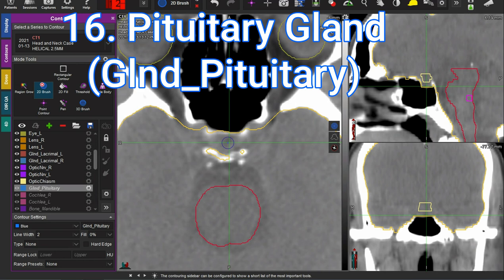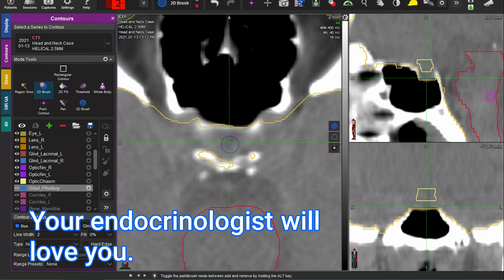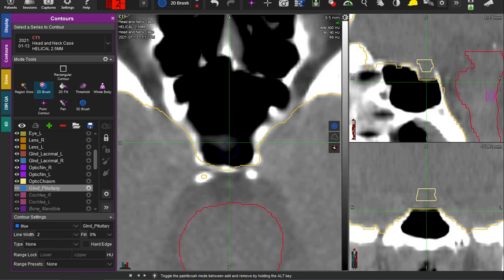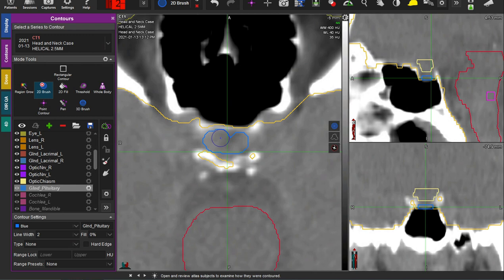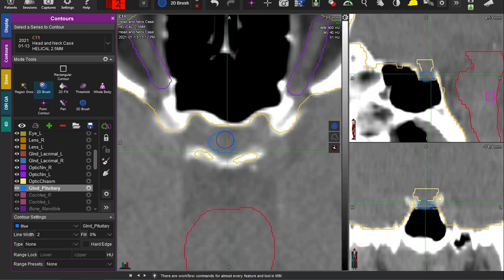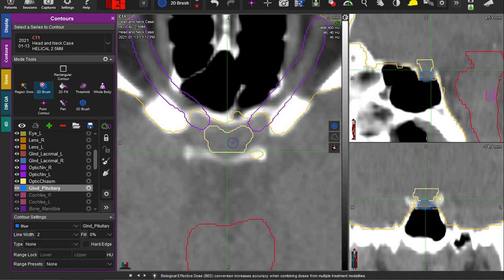Next, the pituitary gland. Sometimes we forget about this because we're not endocrinologists, but our patients and the endocrinologists we work with really appreciate if we can spare the patient from suffering hypopituitarism. I go to the last slice of air before getting into the sella turcica — this fossa — and the pituitary sits in the bottom of this fossa. Zooming in close, can you convince yourself that there's something here? That's pituitary. And we are to the optic chiasm. Usually there's a pituitary stalk — it might be here, but I'm not going to draw it because it's already overlapping my chiasm.